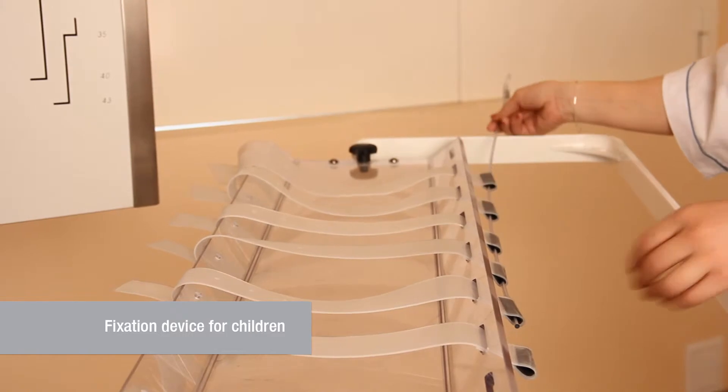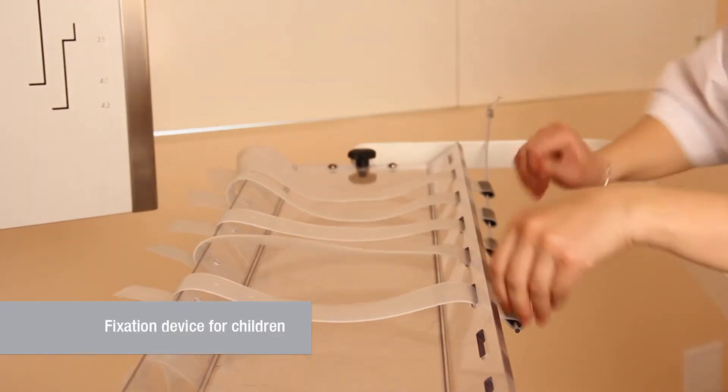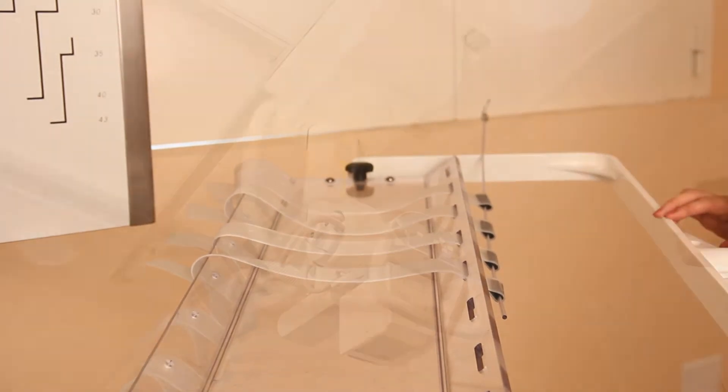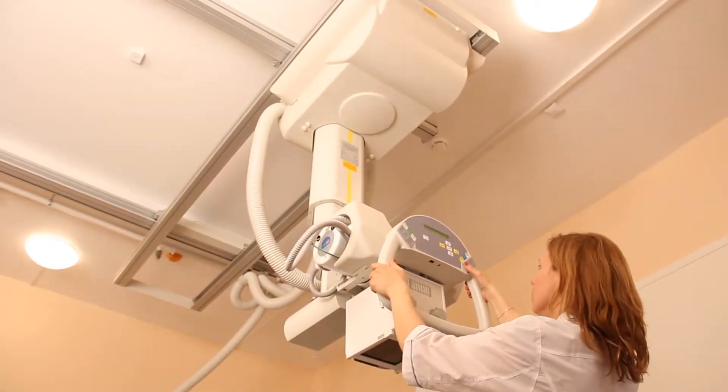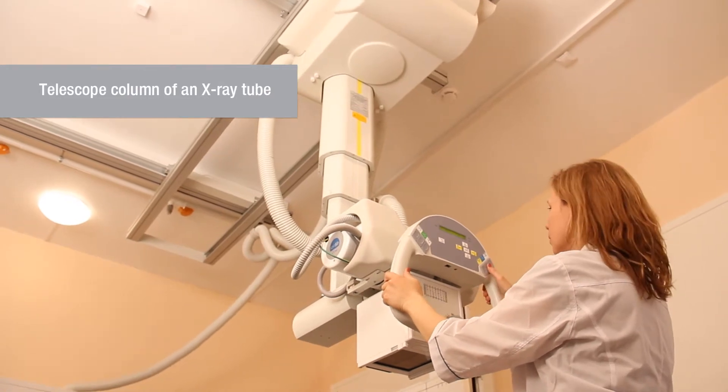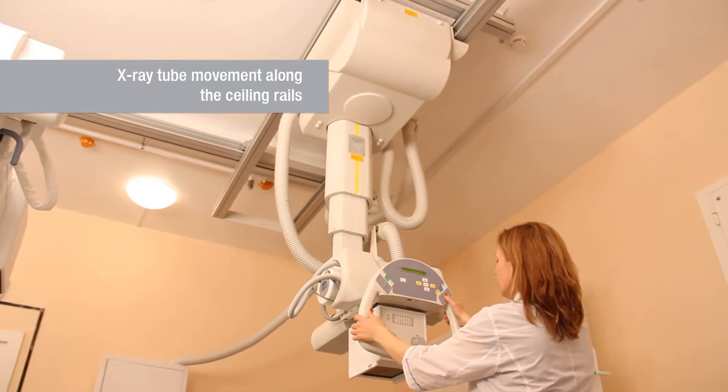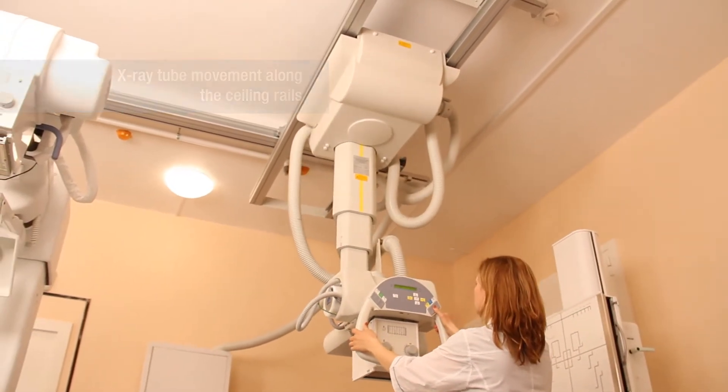Fixation of the youngest patients is done in a horizontal position. Combination of the telescopic stand with ceiling rails in combination with wheelchair or wheeled bed widens the range of tube positioning.